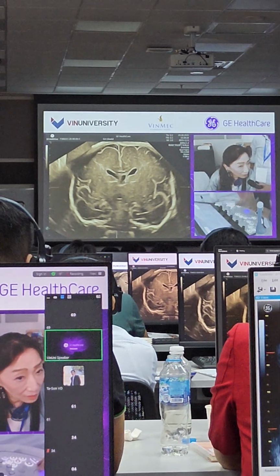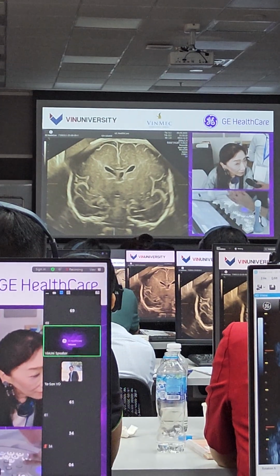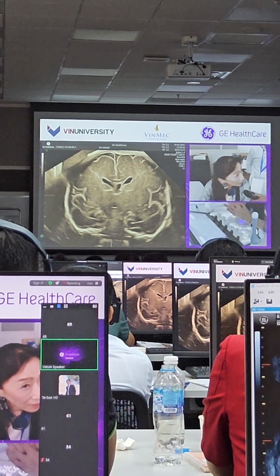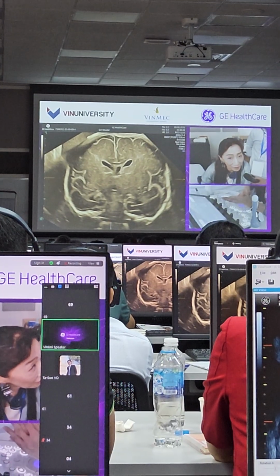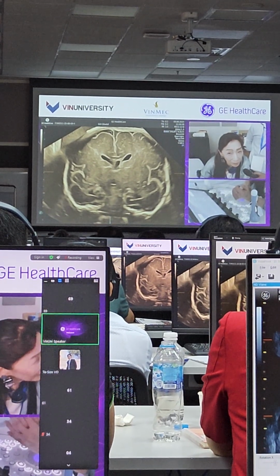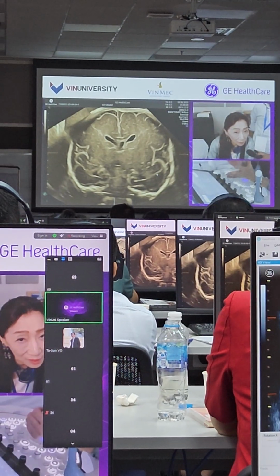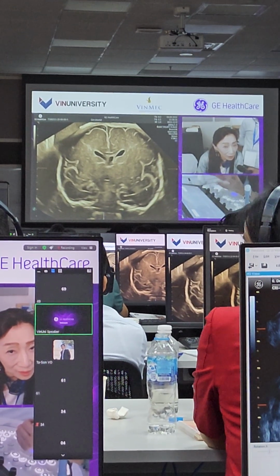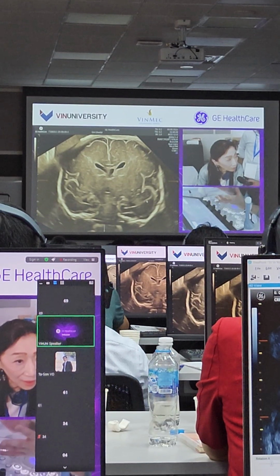The consultation, you know, the counseling of the patients is a bit difficult. However, I think most probably this is, and maybe from now on, the asymmetry of this brain is much more conspicuous.